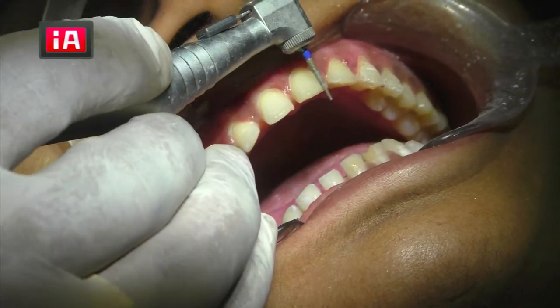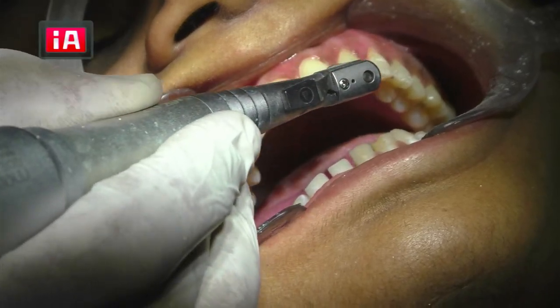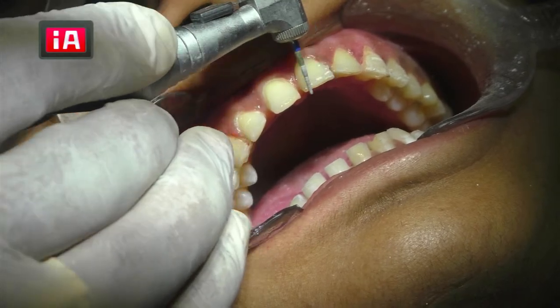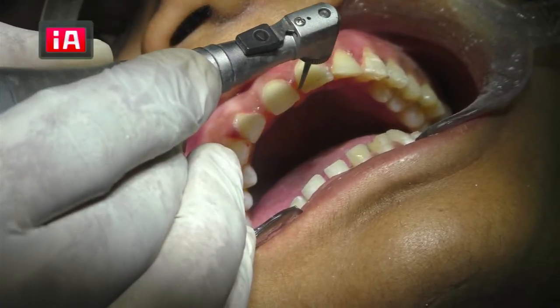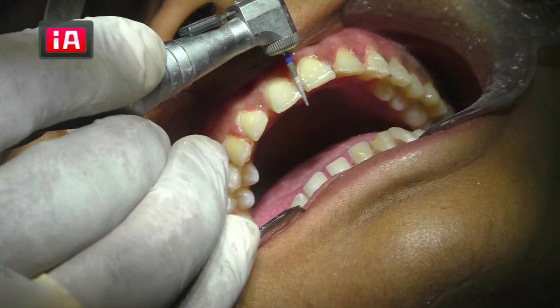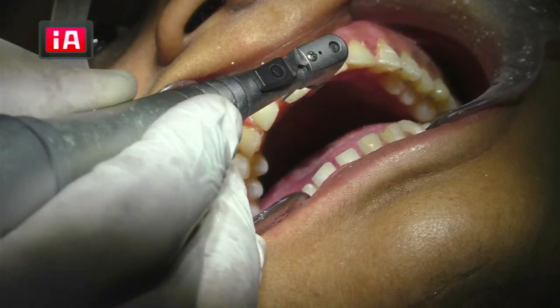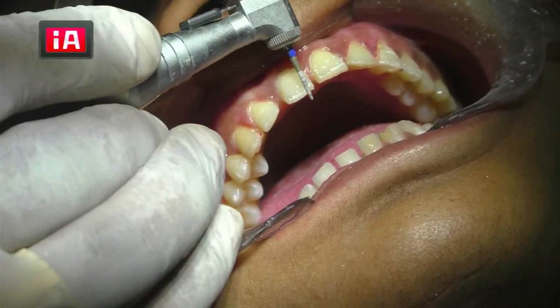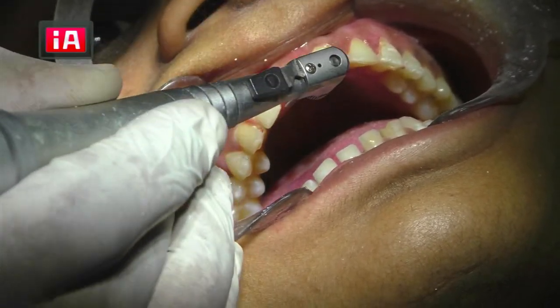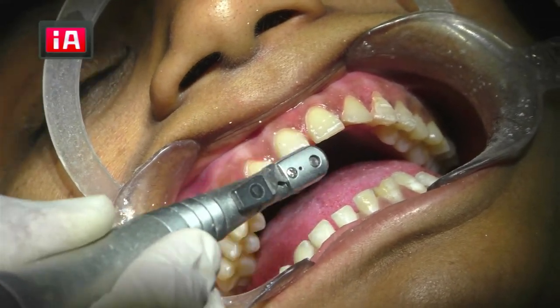And remove all the sharp angles, okay? There should not be any sharp angle. That acts as a stress point and the veneer may chip off, because these veneers are very small in nature, very, very fragile. They are all made up of glass particles. So you should be very careful in releasing all the sharp angles.